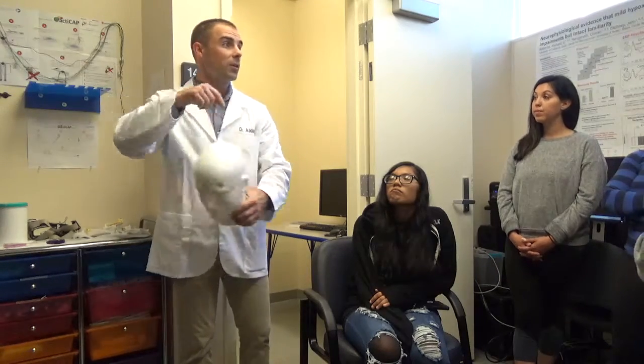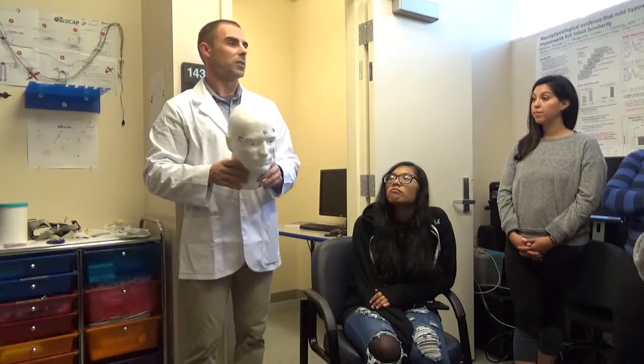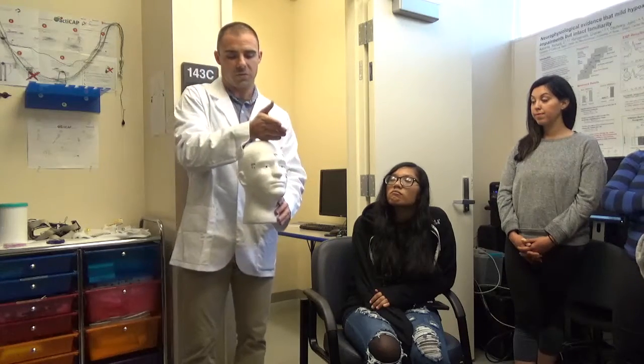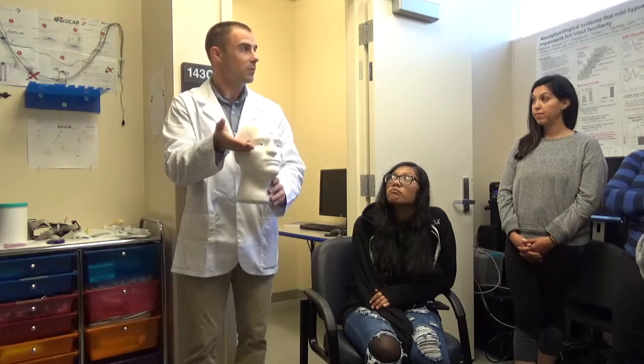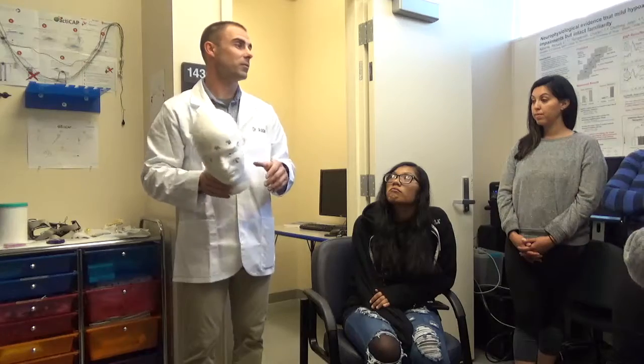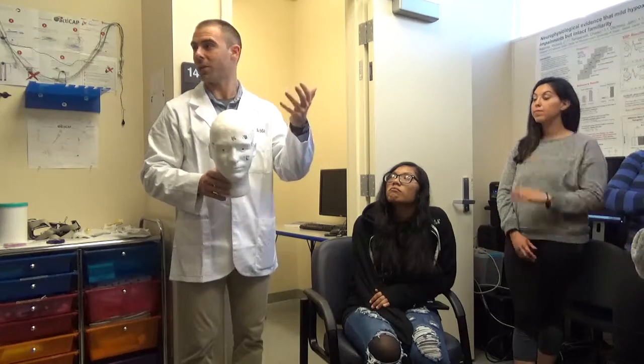Now here's where the other numbers come in. So that's just 0. You guys know odds and evens, right? Okay, so anywhere to the right hemisphere, away from the midline, as you move more laterally, those numbers are going to be even numbers. 2, 4, 6, 8.